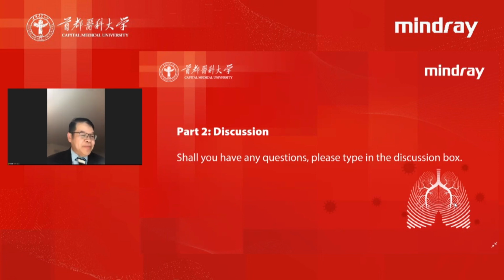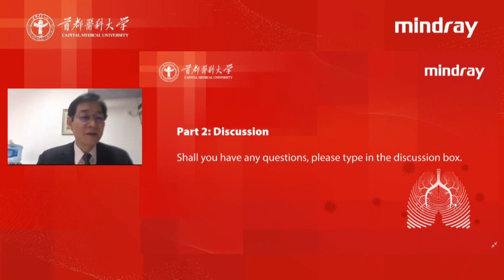It's a good question. If a patient is under quarantine in the hospital, at least 3 CT exams are necessary to observe the progress of suspected lesions.